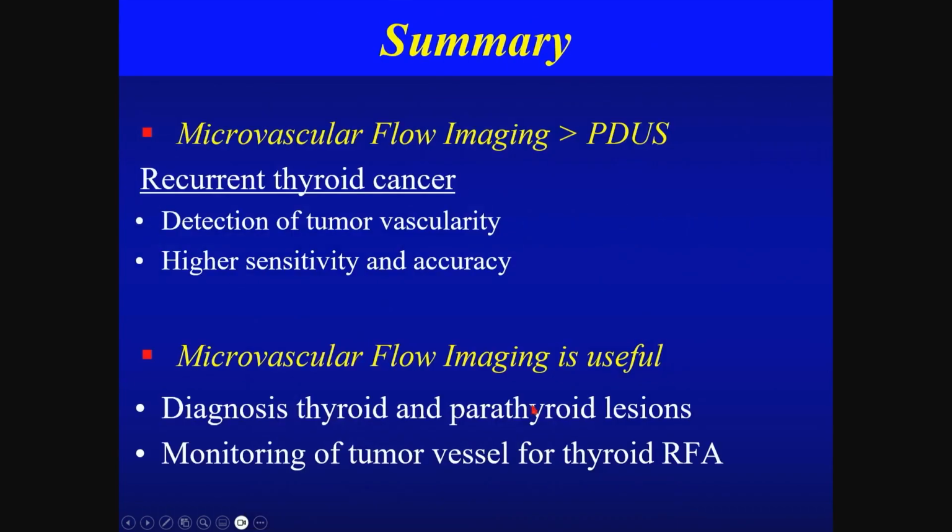So today I introduced our recent publications comparing microvascular flow and power Doppler. Microvascular flow imaging shows better results in recurrent thyroid cancers in terms of detection of tumor vascularity and achieved higher sensitivity and accuracy.